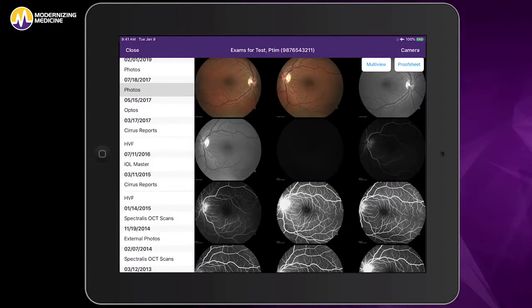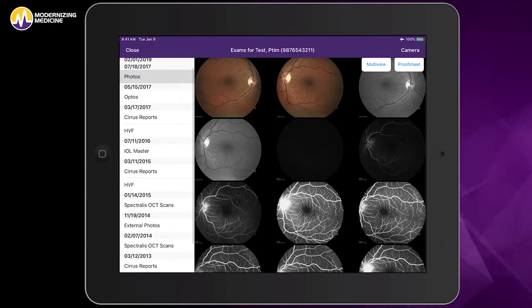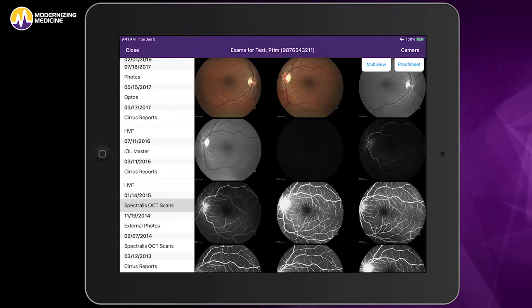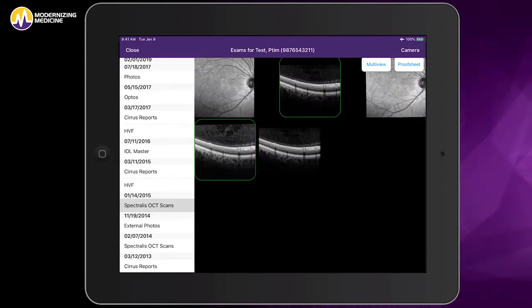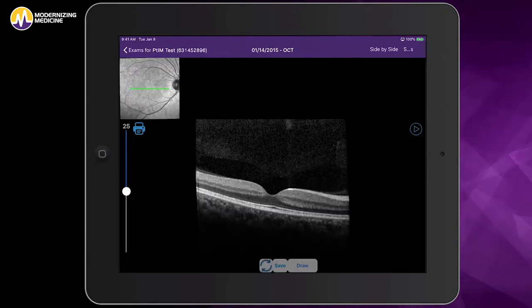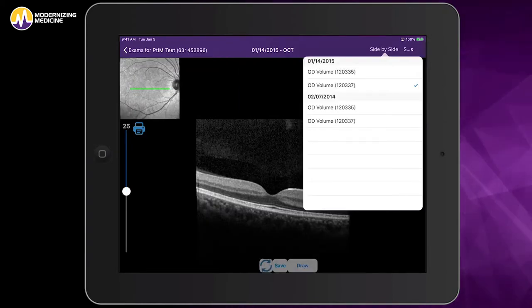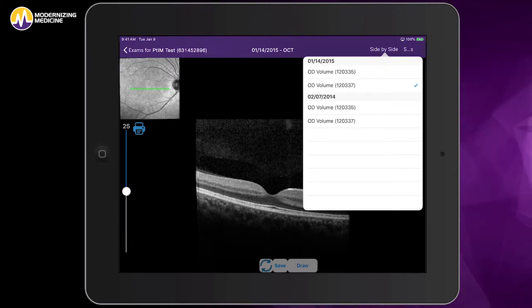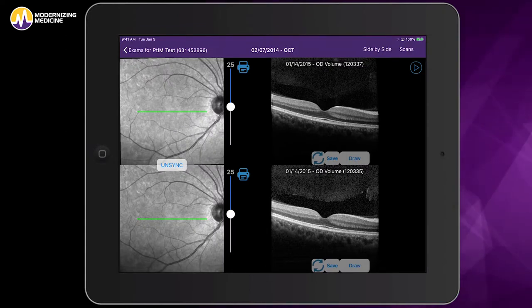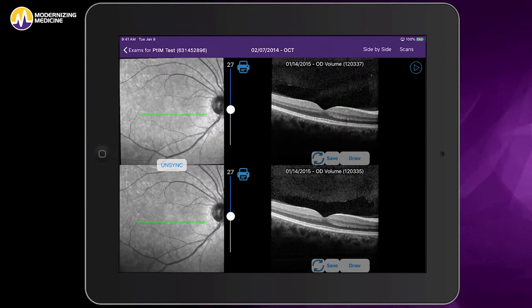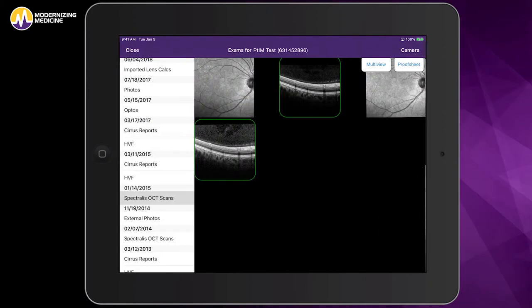This gives me access to the patient's images. I can easily review the images imported minutes earlier from the connected diagnostic equipment, or stored from previous visits, including different exams. I can also compare the clinical evolution to confirm or adjust my diagnosis and course of treatment. For example, to review the OCT, I just touch or click on one image, and I can easily scroll through the OCT slices and sync images to compare side-by-side.